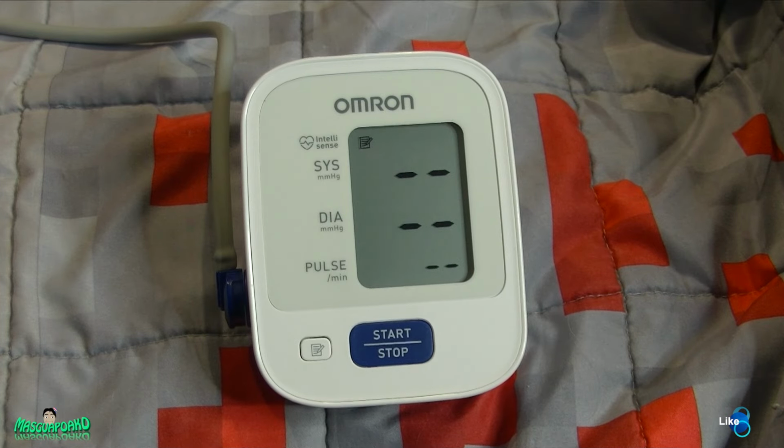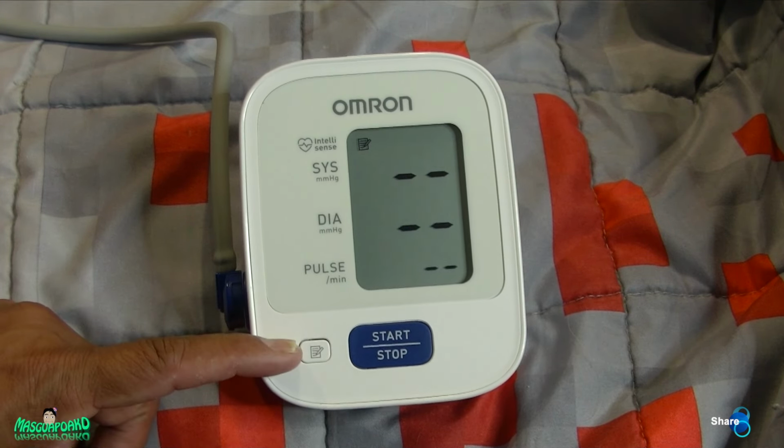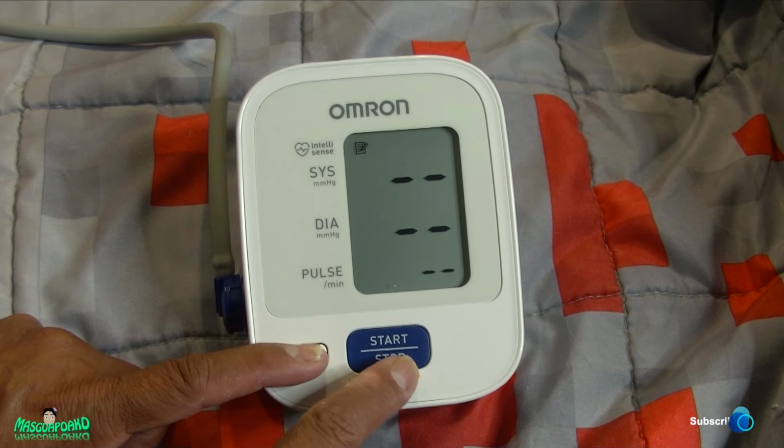Alright, so this is the Omron Series 3 blood pressure monitor, and this is how you delete the stored memory by just holding this button and the start and stop button.